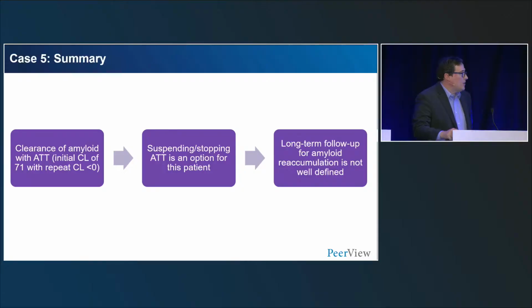All right, to summarize, so this patient, their Centiloid is clearly in a normal range. Stopping the treatment is an option. A question is, should we be imaging these people again if they have long survival to reinitiate therapy? We're not there yet, but I think that's going to be a question that may come up in the future.